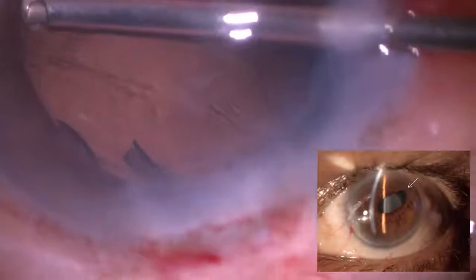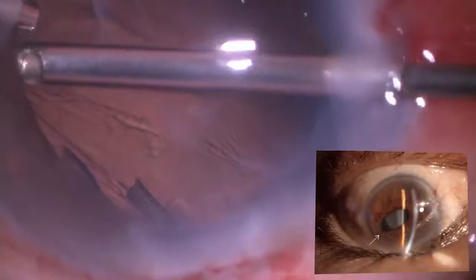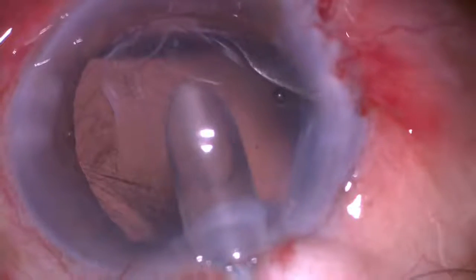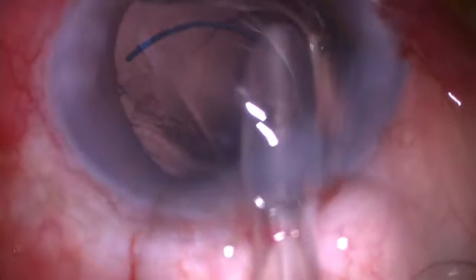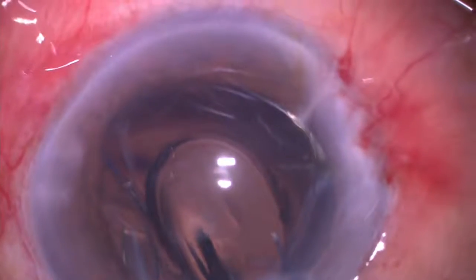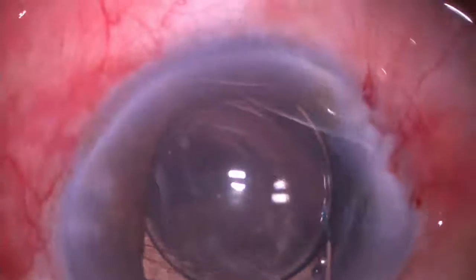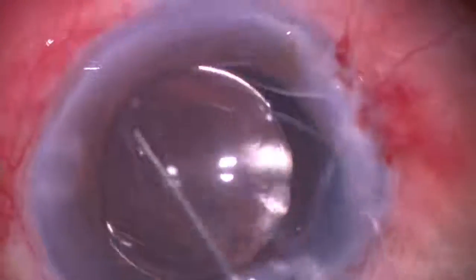Vitreous strands were released by performing a localized vitrectomy. The fibrosed ends of haptics were retained in the bag. During implantation, the multi-piece hydrophobic spherical IOL flipped upside down. However, it was retained in the same position to avoid damage to the capsular support.